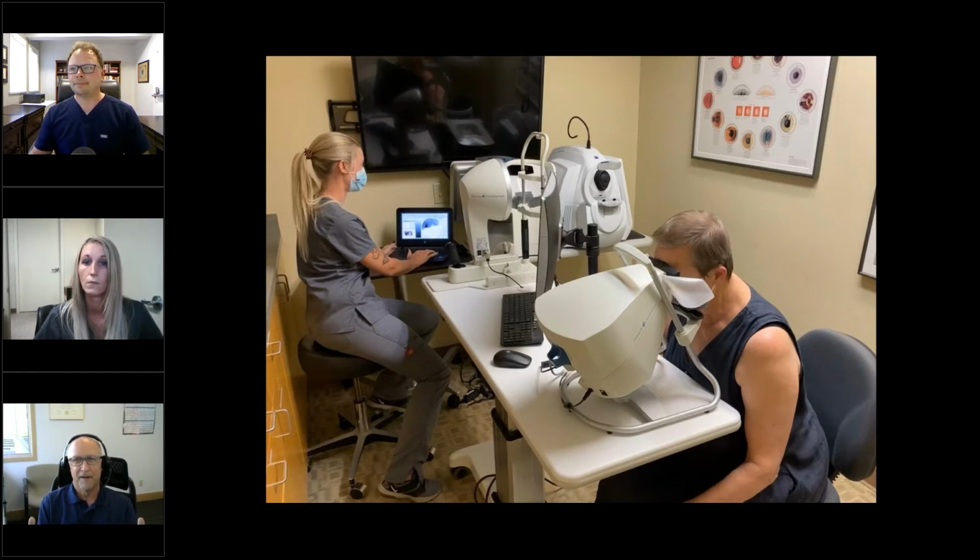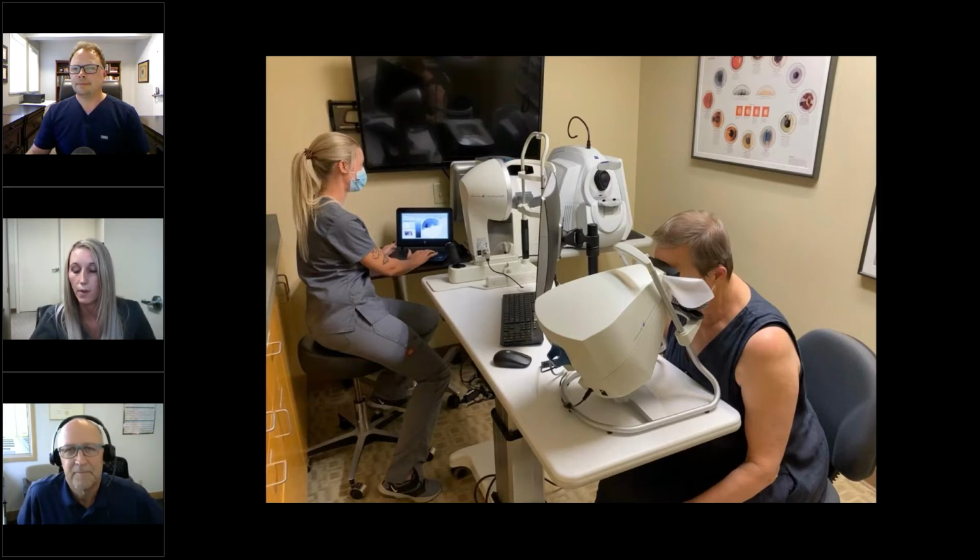You need them not tired, you know, and so usually, for the previous methodology, it was probably best to bring them in on another day to schedule that. Well, not only that, but we have a full schedule of special testing already. So we have our own schedule for testing, and to be able to fit a Humphrey into the middle of a full schedule already was impossible.